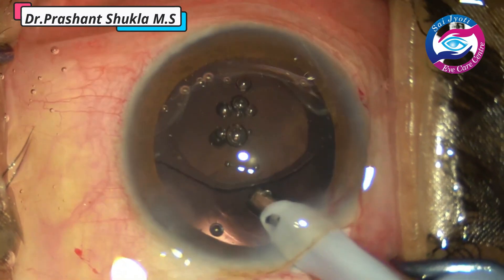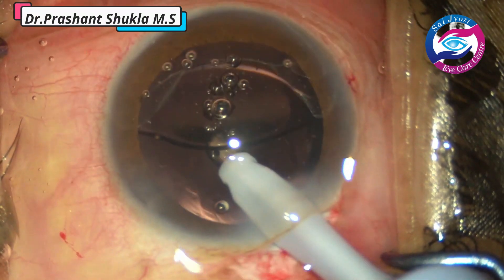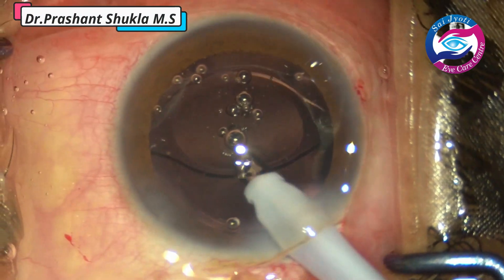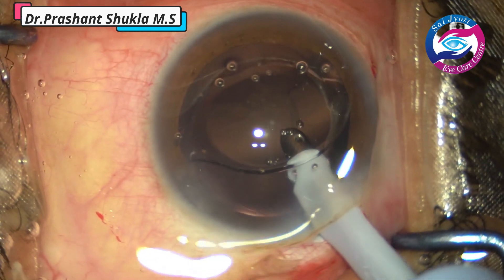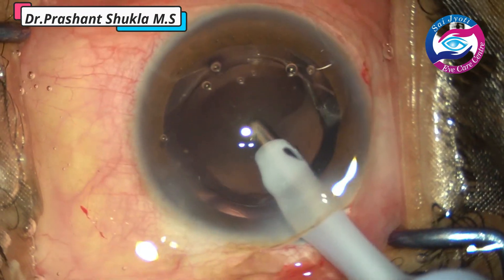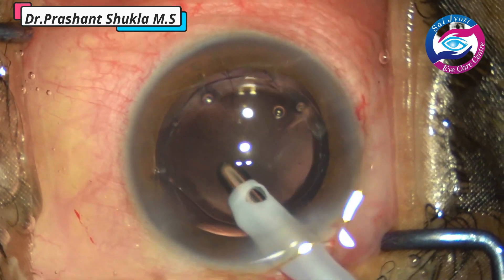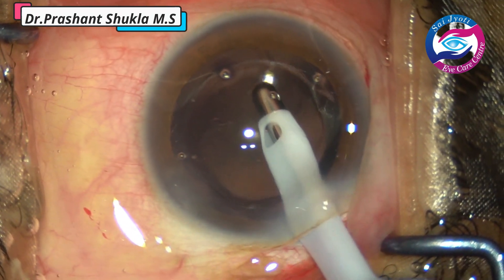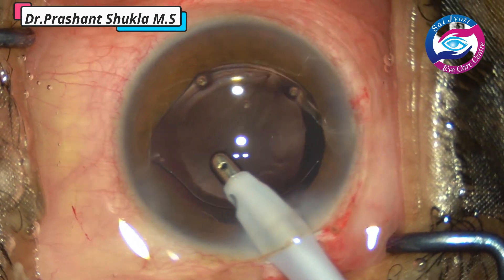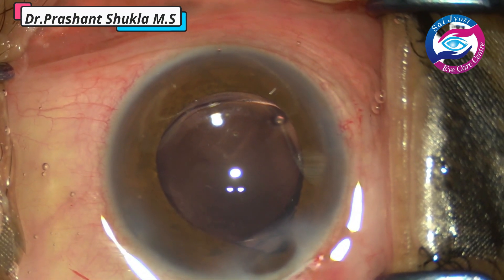Now it is time to remove the viscoelastic from the eye. The coaxial irrigation aspiration handpiece goes behind the intraocular lens, with the port purposely facing towards the intraocular lens and not towards the posterior capsule — because if we face the port towards the posterior capsule there are high chances of catching it. Vacuum being used is about 450 and bottle height is kept at 100 centimetres. Then the viscoelastic from the anterior part of the IOL is removed. With hydrophobic lenses, HPMC sticks very much on the surface of the lens, so we must make sure to remove all the viscoelastic.